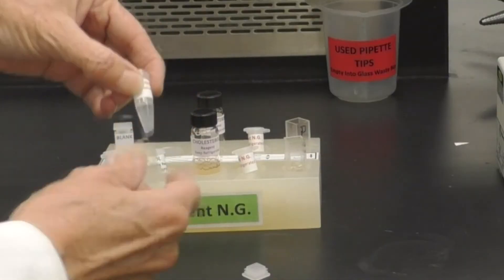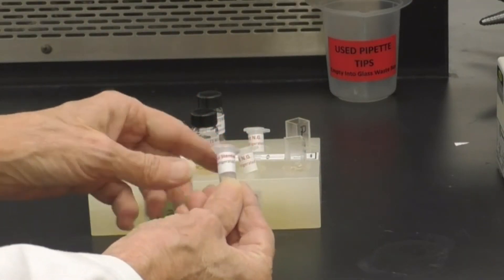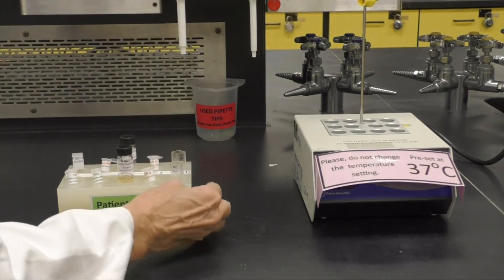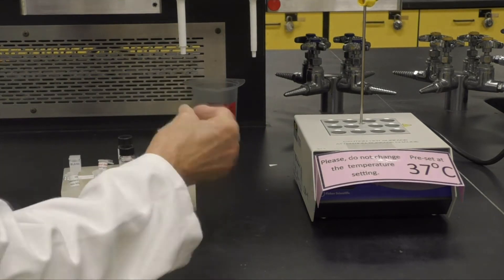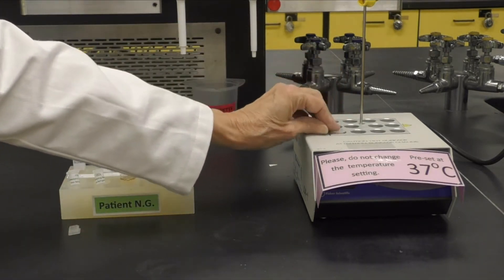Then add 20 microliters of the cholesterol standard. Make sure it is not the HDL standard into the cuvette labeled as the standard. Cap it, rock gently to mix, and place it in the dry bath incubator for 5 minutes.